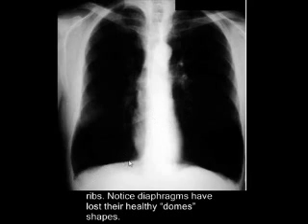But the other signs of emphysema are also visible. The diaphragms are somewhat flat. These should be dome shaped naturally, and the lungs should not be visible beyond the 9th posterior rib. So such conditions are thought to be a result of loss of elastic fibers.